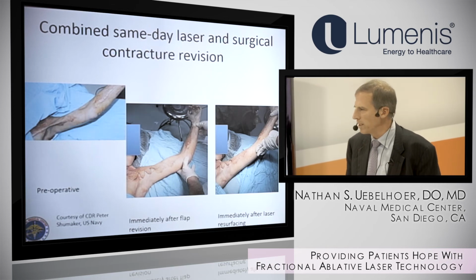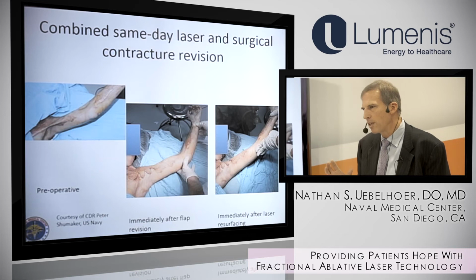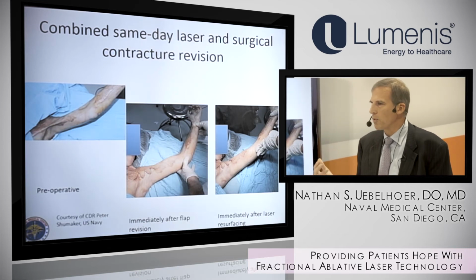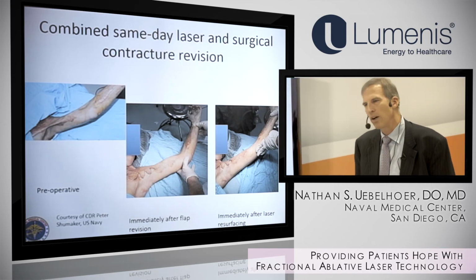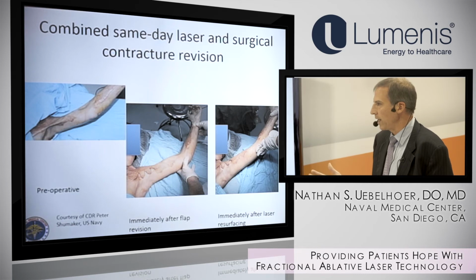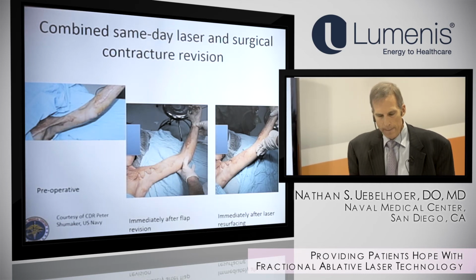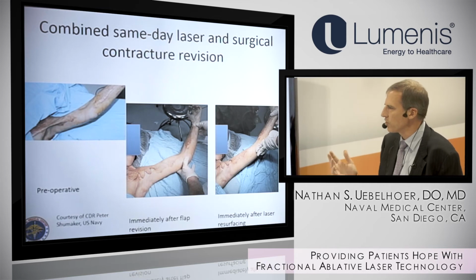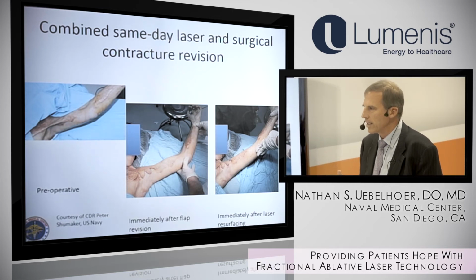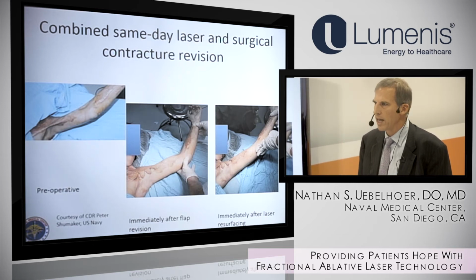And that's a great point to show a couple of things. First of all, this laser treatment is not a monotherapy. This is to be used with everything that we're already doing for scars. It's not to take away what the plastic surgeons are doing, except maybe require less revisions to these scars. And the second thing is this is a treatment that you can do one time on a patient and have the confidence that there's going to be a very, very low risk to that patient.